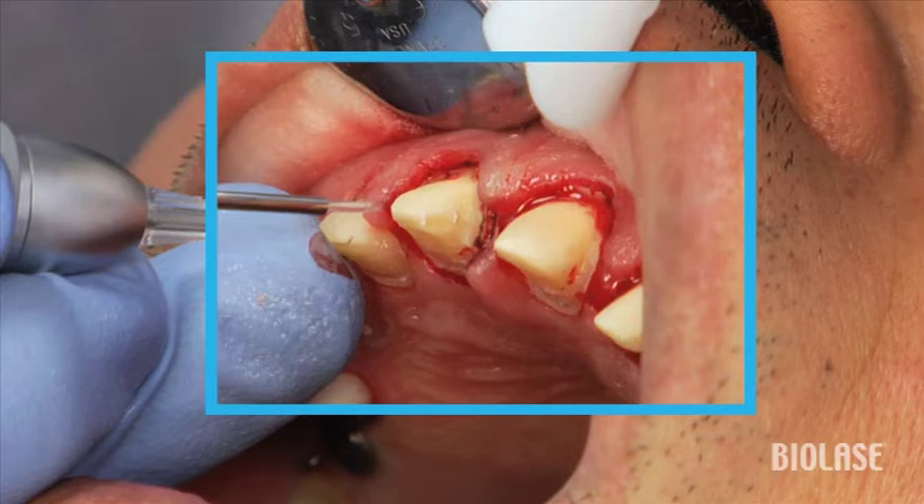The third tip is: if you overheat the tissue to the point that it becomes blanched or white, know that this tissue will no longer be there when the patient returns to insert their restoration. You've overheated the tissue and it needs to be removed at this appointment immediately. When troughed properly, using the proper protocols, the tissue will remain exactly where you left it at this stage of treatment.